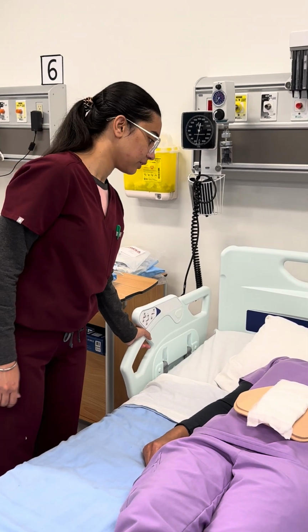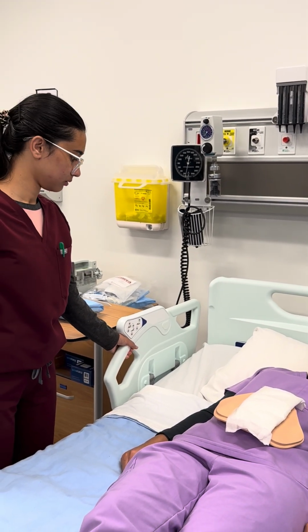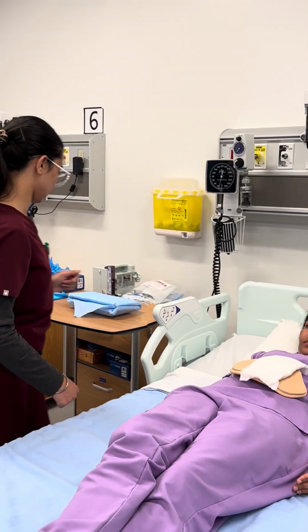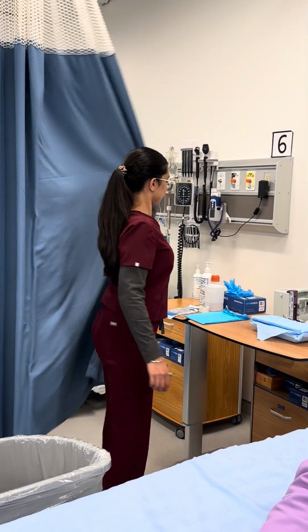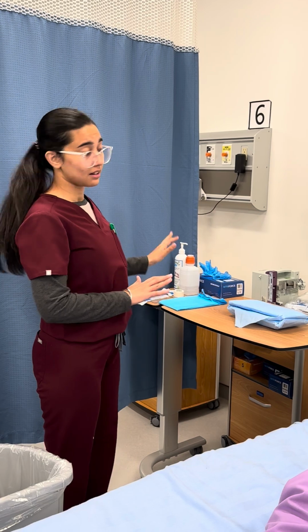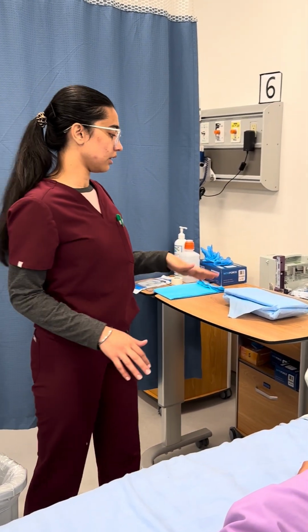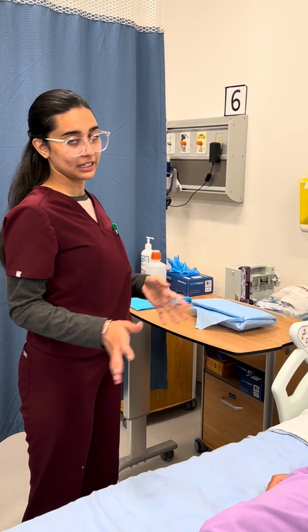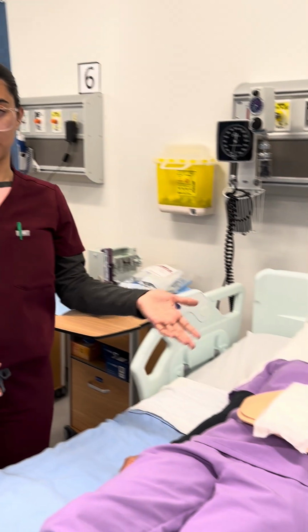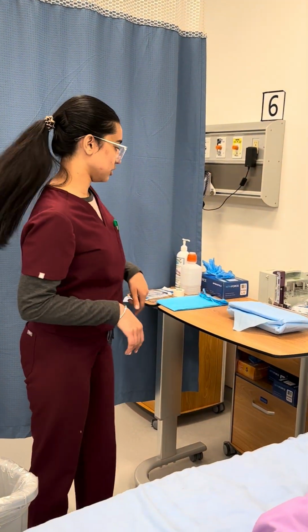I'm going to raise your bed, okay? Can you move a little towards me? Providing privacy to the patient. So I've gathered all my supplies that I need on a clean area, and also I have maintained the sterile triangle with my sterile kit on a clean area first, then my patient or the wound, and then the discard area. So now I'm going to start with the procedure.